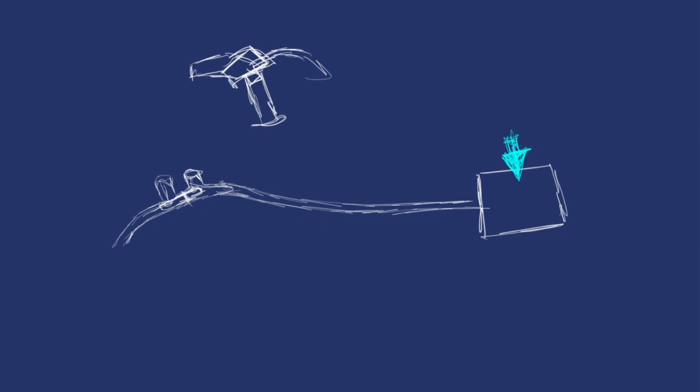If we put this into the patient's nose and they breathe off CO2 into this, we can't zero to the atmosphere out here if we're zeroing to this in here. So if you're zeroing the equipment, it needs to be detached from the patient so we can zero it to the atmosphere, and then we can plug it into the patient so we can see the difference between the atmospheric CO2 and the CO2 that's being expelled.